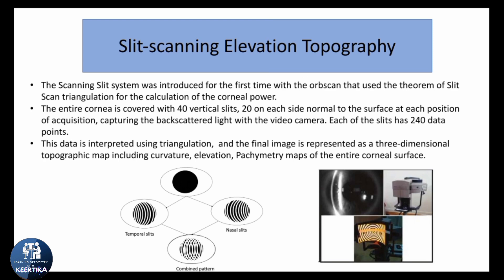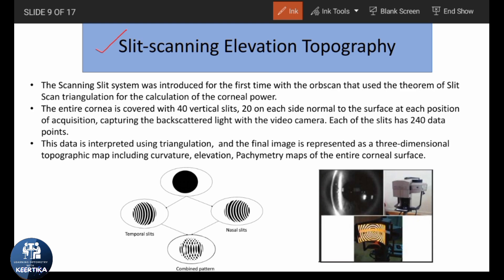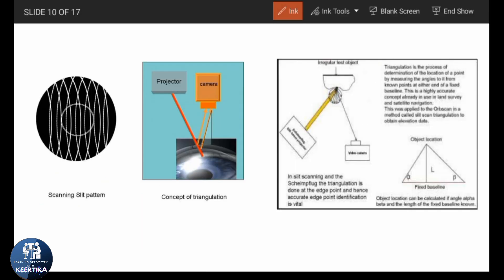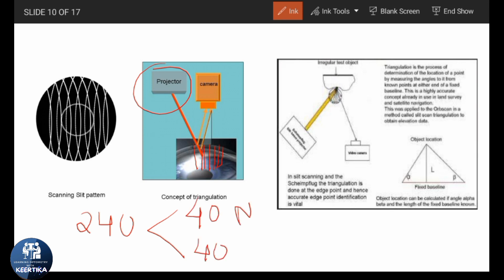The next technology is slit scanning elevation topography, also called scanning slit elevation technology. Because Placido disc only gives information about the anterior surface curvature and more posterior details are needed, this technology was developed. In this, multiple complementary slits are used to perform assessment of the corneal surface. An example is Orbscan, in which around 40 slits are projected — 20 from the nasal side and 20 from the temporal side. The projector continuously forms slits from both sides, evaluating around 240 points on each slit. With 40 slits total and 240 points per slit, this is an extensive study that can provide anterior curvature, posterior curvature, elevation, and pachymetry maps of the entire corneal surface.